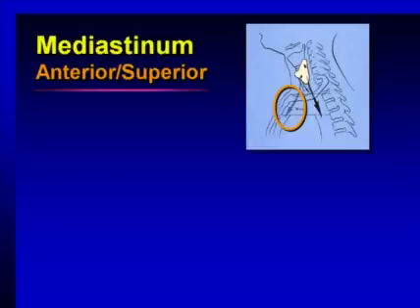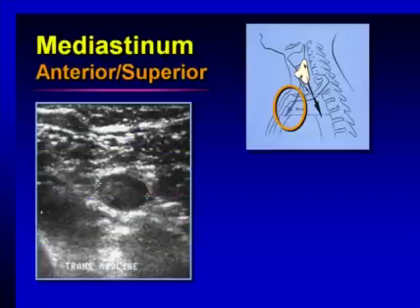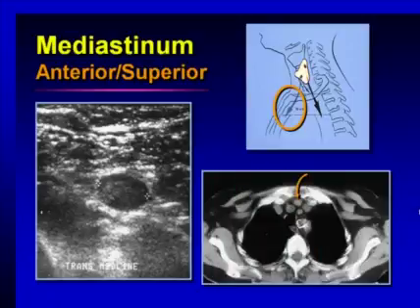When an inferior gland is ectopic, it has generally continued its embryologic descent along with the thymus into the anterior superior mediastinum. The surgeon, if they don't find the gland in the normal location, will then start to tease up the fatty tissue behind the sternum to look for these adenomas. We can do the same by angling behind the sternum, and we may see a bean-shaped mass within the more hyperechoic tissues in the anterior mediastinum. The same adenoma, even though it's located directly behind the bone, by angling caudally, we can often see these sonographically.